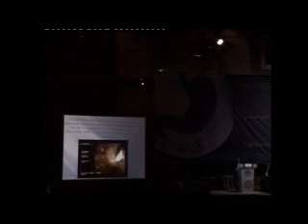Because of the pancreatitis and the bulging papilla, we decided no need to bother the orifice of the papilla and to go ahead with the supra-orifice pre-cut. As you see here, part of the stone started to appear, and you go at 11 o'clock, as Ibrahim said, and you can now appreciate the stone started to be seen. Now, I decided, because it was impacted deep, to take the roof of the orifice and cut it upward, and as you see now, the stone started to come down, and it came down. Now, the patient recovered in 24 hours, discharged 72 hours after admission without any complications.